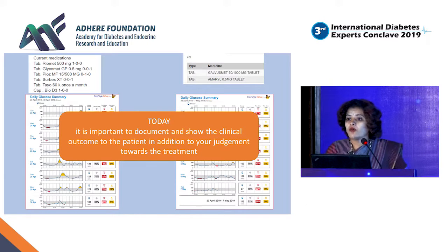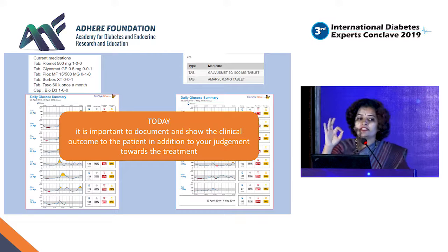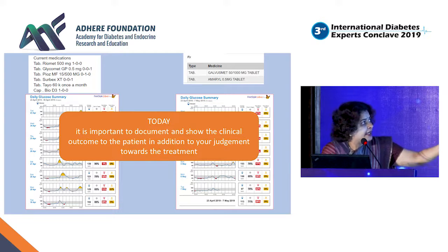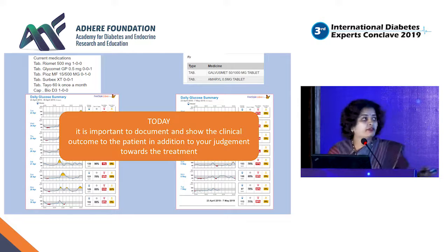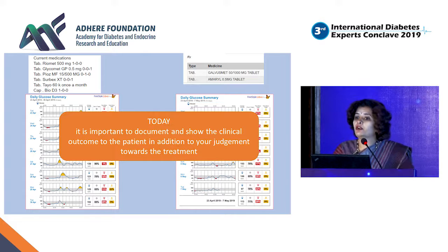Okay? What we need to see here, the most important use of CGM is to identify hypoglycemia. This is the first thing, because if you look at this high level, it is always preceded by a low. And this is the most common thing that happens when patients are over-medicated. They have hypoglycemia and the counter-regulation will cause hyperglycemia, either overeating or hormonal counter-regulation. So if we take care of the hypo part, the hyper part automatically comes down.